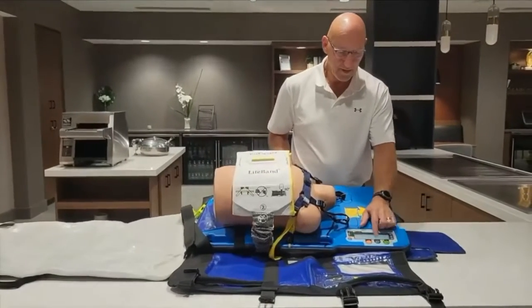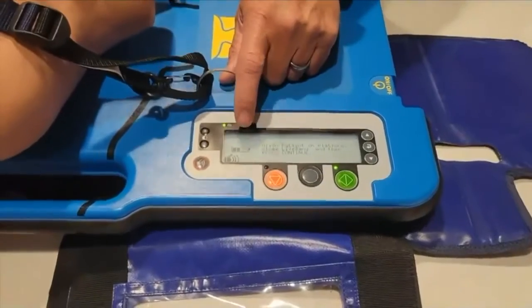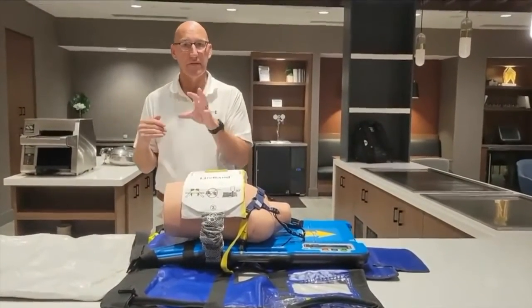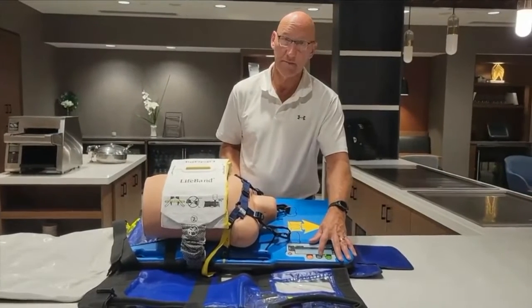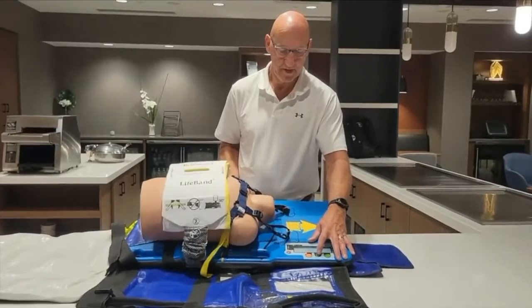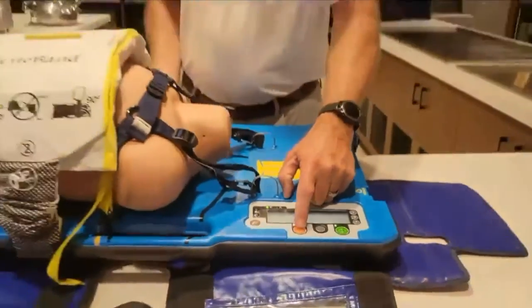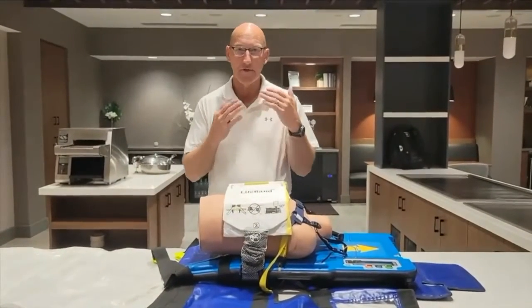A couple of other features on the control panel: this gray button — the boards from the factory will power up in a 30-to-2 compression-to-ventilation ratio. On compression 28, 29, 30, the device will provide audible prompts so the ventilator can prepare for the three-second pause to deliver two ventilations. It's simply activated by pressing that gray button once and confirming it a second time. In continuous mode, the AutoPulse will provide an audible prompt about every eight compressions as a guide to help the ventilator slow down while ventilating.